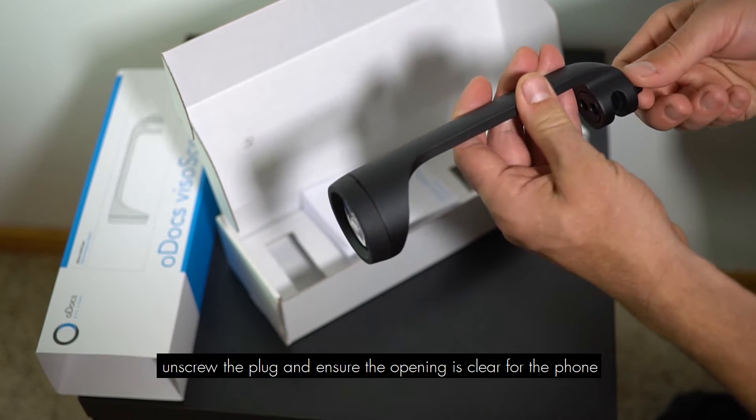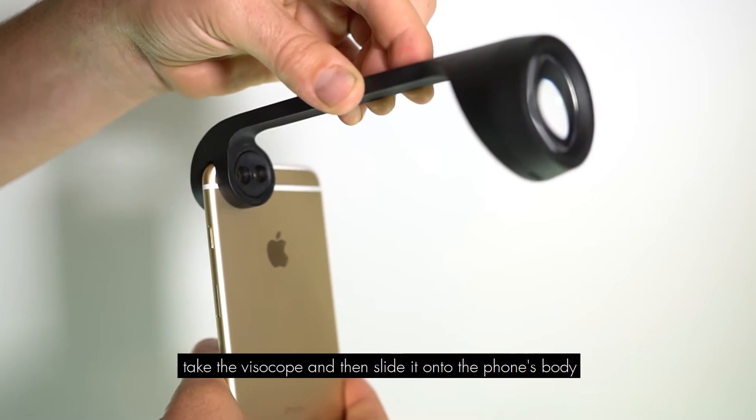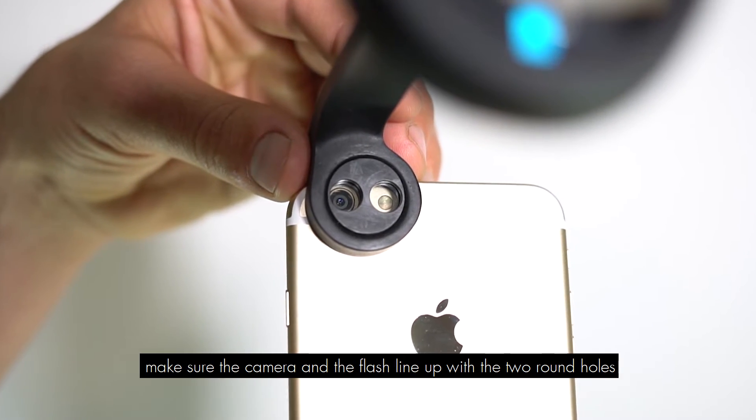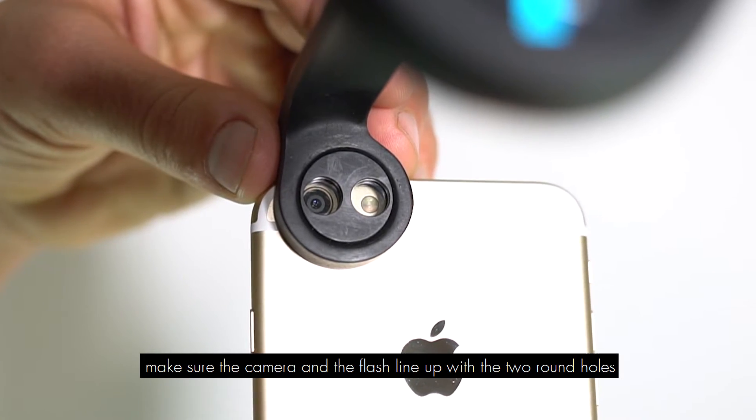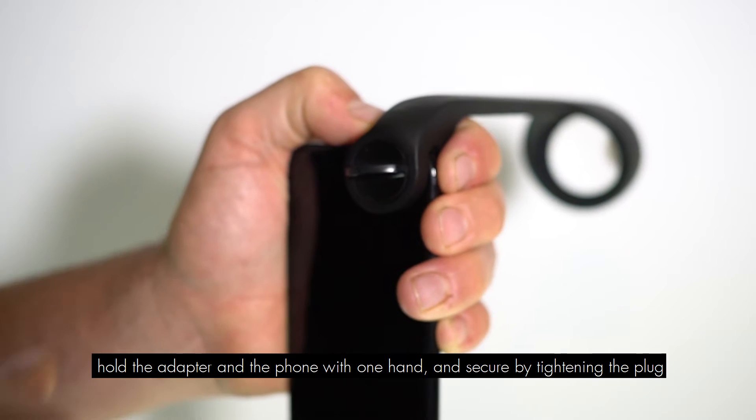Unscrew the plug and ensure the opening is clear for the phone. Take the visoScope and slide it onto the phone's body. Make sure that the camera and the flash line up with the two round holes. Hold the adapter onto the phone with one hand and secure by tightening the plug.